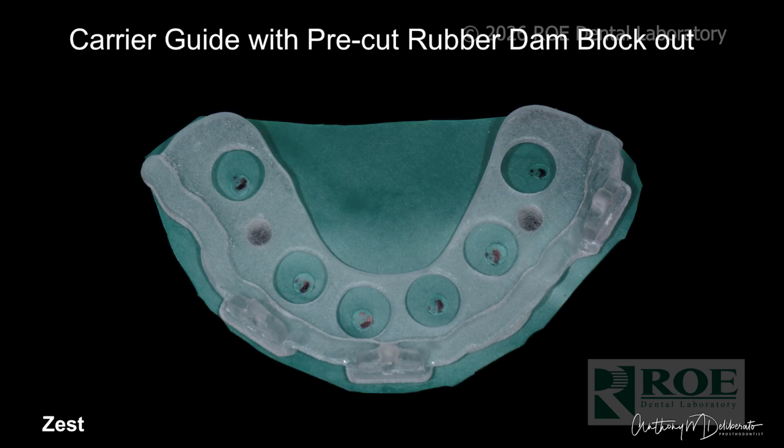And what we do is we pre-cut these rubber dams so that when we're doing our intraoral pickup and injecting acrylic, we don't want anything to go down under the flap and cause a problem. So we want to keep it as clean as possible. So we'll just use a rubber dam punch, and we'll put some holes in that rubber dam to fit over that carrier guide.